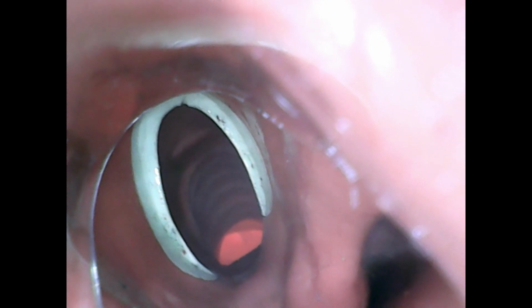Okay, now we're going to give you a view of what I'm seeing when I intubate with the Vie Scope. So we come in for the tongue, and then we visualize epiglottis, vocal cords within seconds. Here's the bougie pass into the trachea. Just like that.